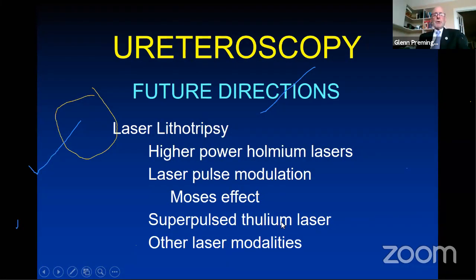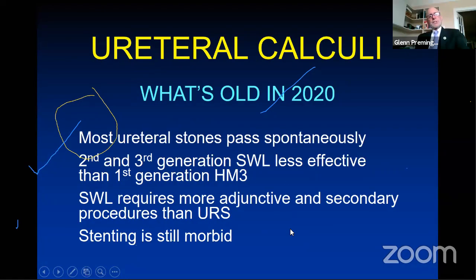So where are we going with ureteroscopy for the management of ureteral stones? Well, I think we'll be seeing more written about high-power holmium lasers, as well as the introduction of the superpulsed thulium laser to fragment stones. And so what's old in 2020? What's old is that most ureteral stones will pass spontaneously, and that second and third generation shockwave lithotripsy devices are less effective than the first generation HM3.